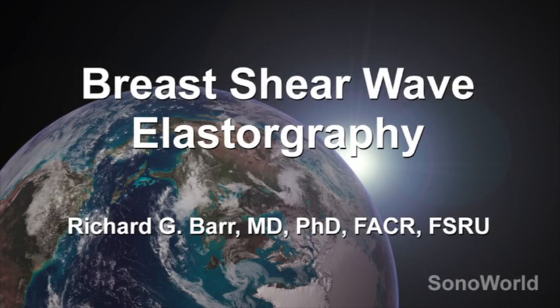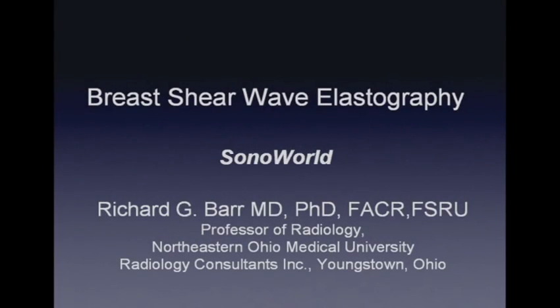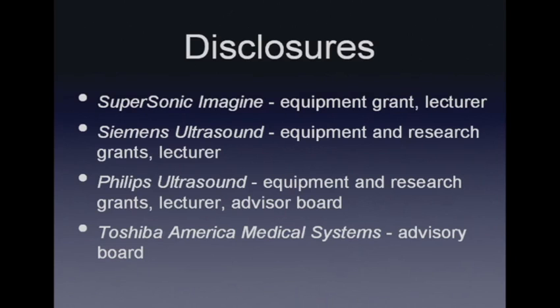Today I'd like to give a follow-up lecture on breast elastography on new developments since our prior talks that we did for SonoWorld. Today I'd like to give an update on our work on shear wave elastography of the breast. This is to follow up the other lectures that we have on SonoWorld.